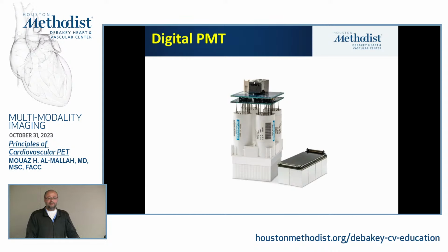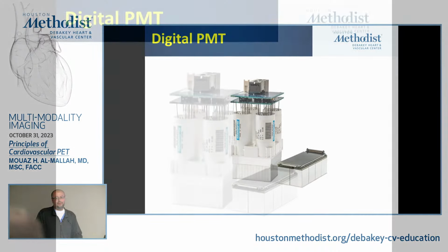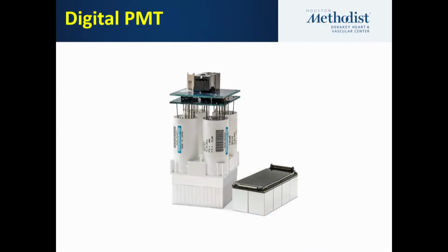What does that mean clinically? You can inject a much lower dose and then image the patient with the same image quality, so you have better image quality. Or if you inject the same dose, you just need a lower imaging time and get similar quality there.